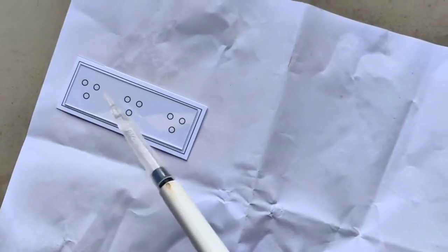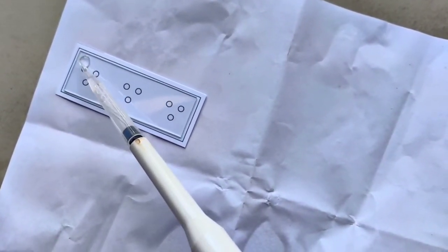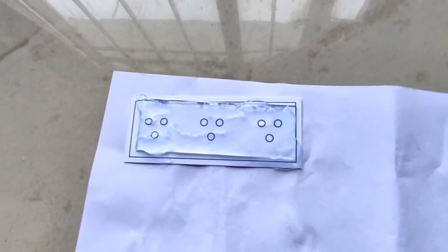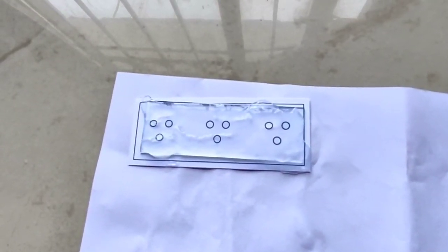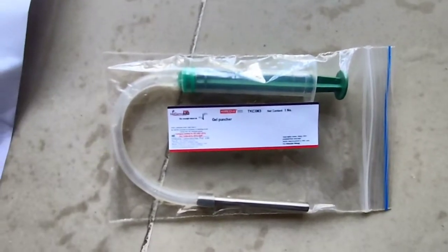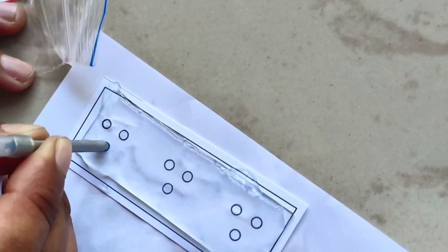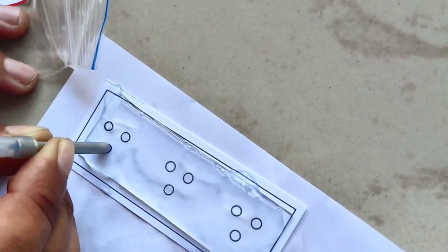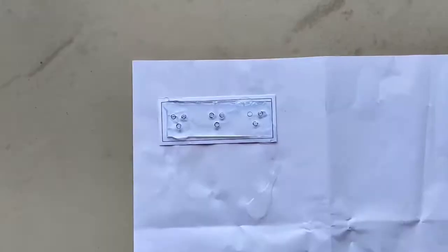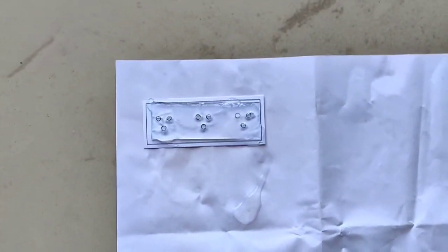Put 5 ml of agarose gel on the glass plate. Now leave the gel to set for 30 minutes. Using a gel puncture, make wells exactly over the template. We have made all the wells in position.